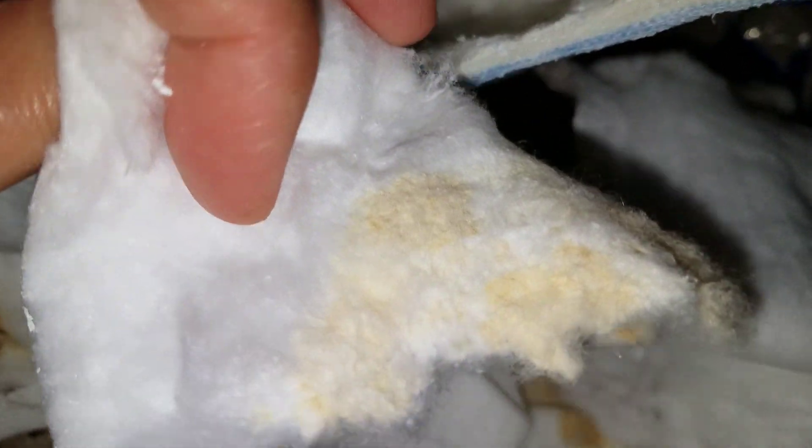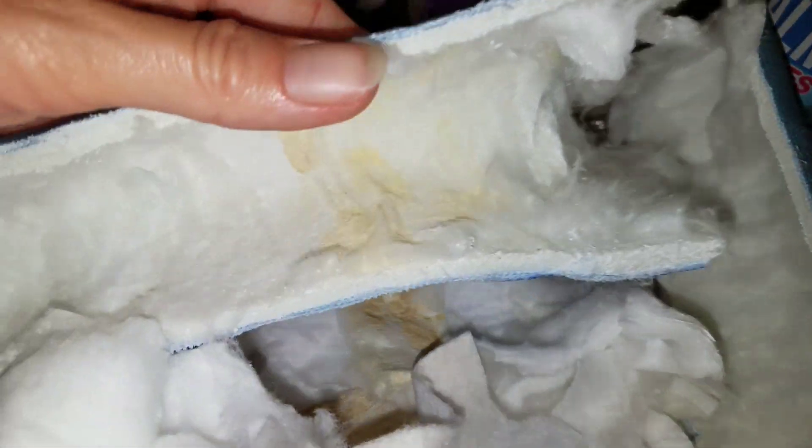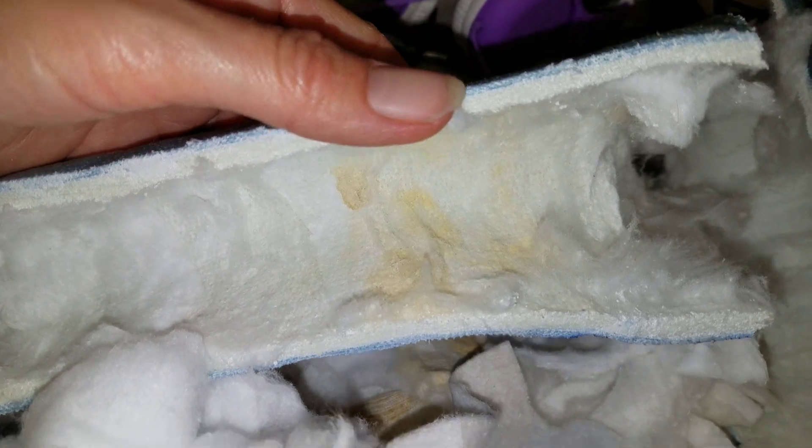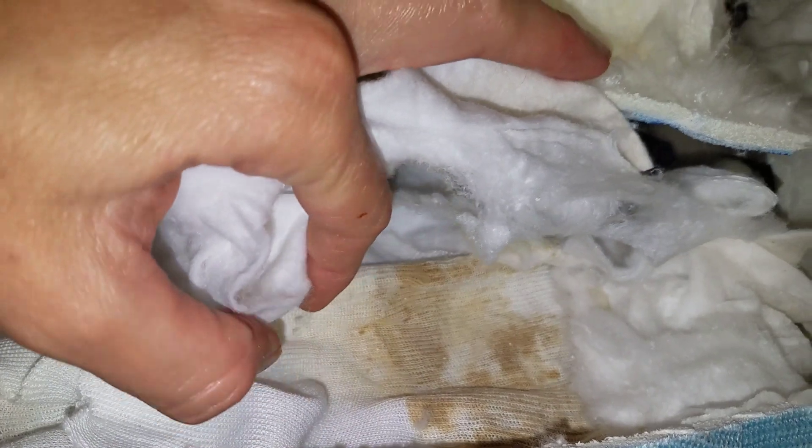This is the back of the cotton batting, and this is the top of it. So there it is. You've got contact dermatitis — you've got that running in your family. It's a risk factor. Don't break any bones, especially don't go get a cast, because it is bad, bad, bad news.